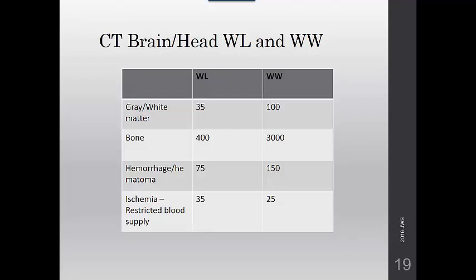In the Romans textbook, at the end of the chapters on imaging procedures of each body region, the authors included a table of general protocols for that particular body region. You may find these helpful, especially after you graduate, if you're tasked with developing protocols for some rural hospital that's never had a scanner before, and you get to develop the thing.